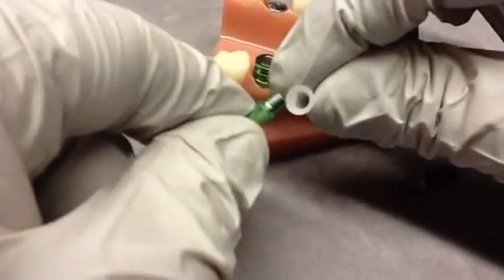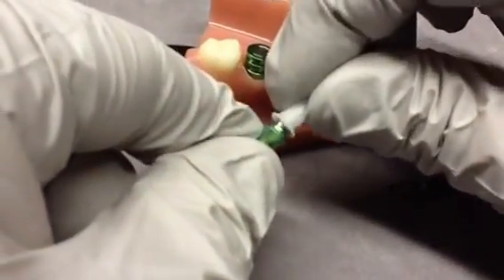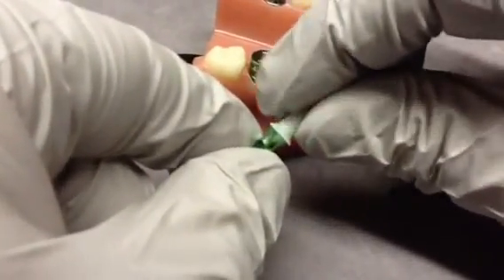This way you preserve the integrity of the margin without having to use a reamer to remove any lip that's left behind on some of the other burnout copings on the marketplace.